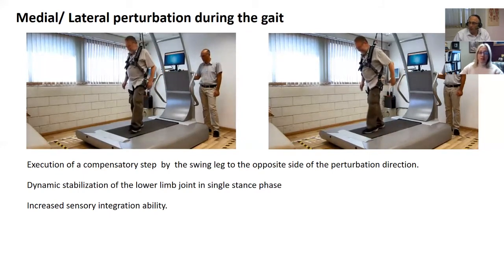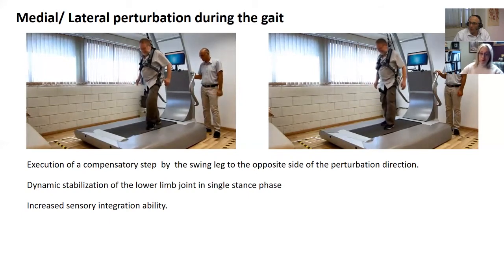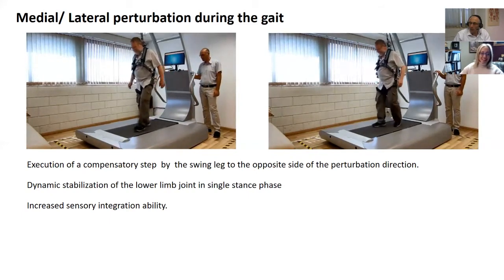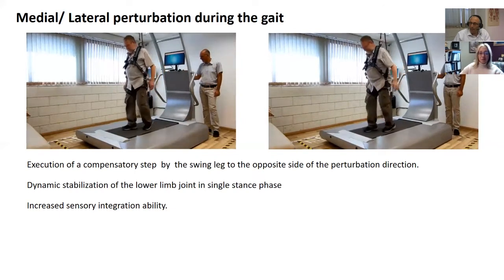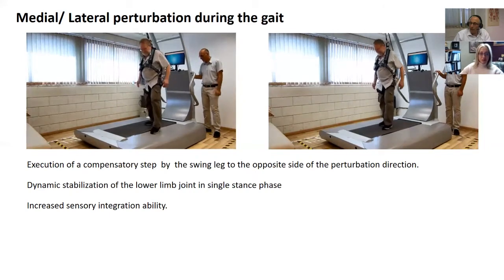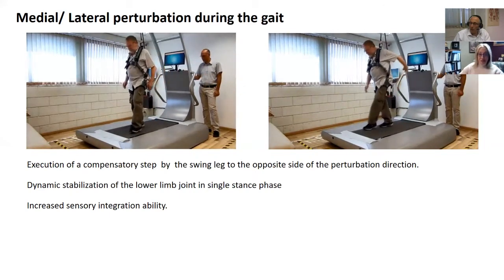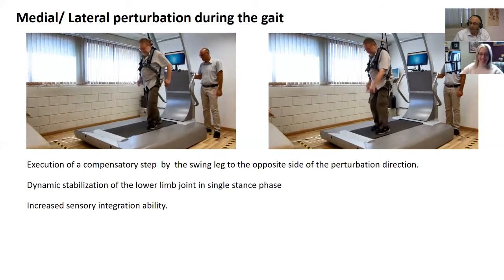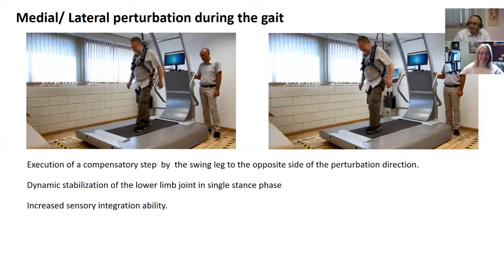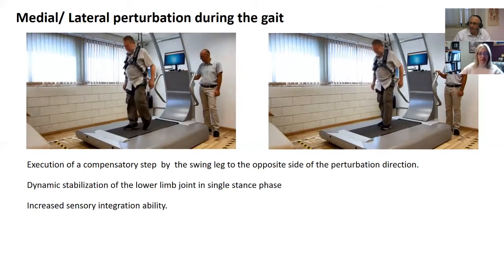Yeah, so you can see that he has a little bit of difficulty getting over to that right leg, or crossing over with the left leg. It depends on how you look at it. When the perturbation's given, as you can see here, he wants to take little steps to just, whoop, there you go, maintain that balance. So it's really kind of fascinating, actually.